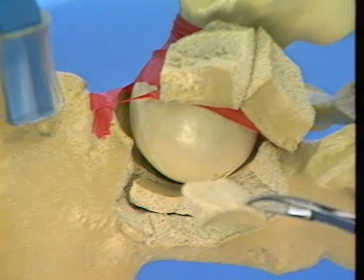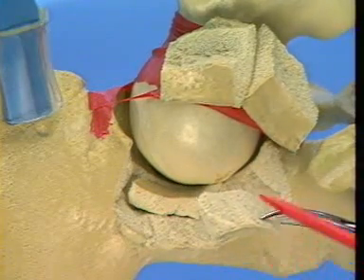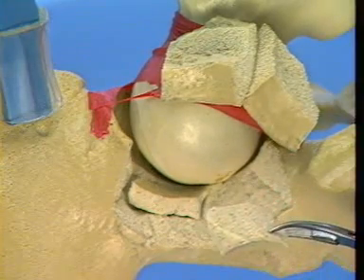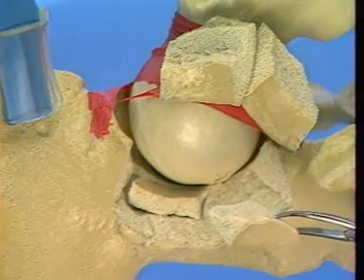An intra-articular free fragment is seen to be covered partially by articular cartilage and to be made up entirely of cancellous bone. This fragment should not be discarded and should be included in the final reconstruction of the joint.